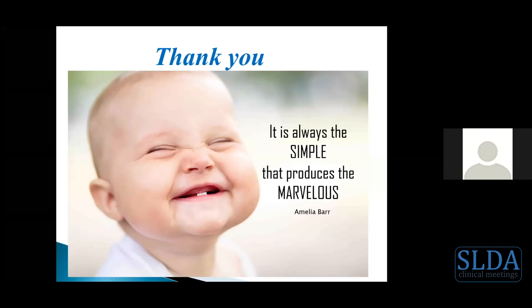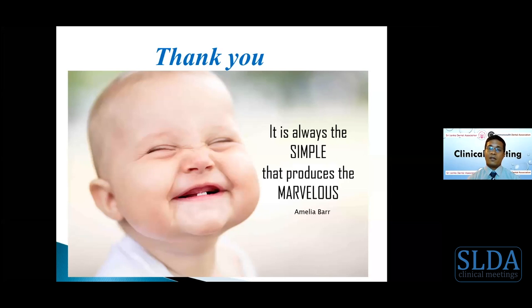Well, that's a very good question. The best thing is to do the occlusal adjustment before you do the cementation, because it's very difficult to adjust zirconia restorations after cementation. So if gross occlusal adjustments are to be done, the best thing is to remake the crown. If you can adjust it with trimming and grinding, then you can grind the zirconia crown and make sure you send it to the dental lab to be polished before you fix it on the tooth preparation. Otherwise, exposed zirconia can cause a lot of tooth wear on the opposing teeth, and they can develop cracks which can propagate into the core of the zirconia crown, leading to ceramic fractures later on.